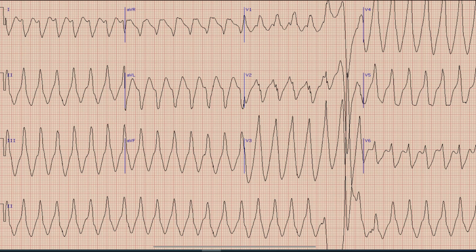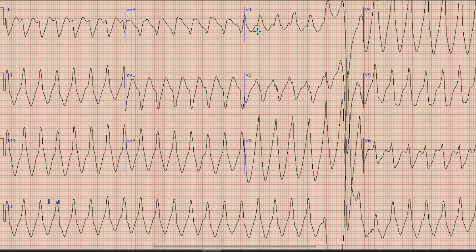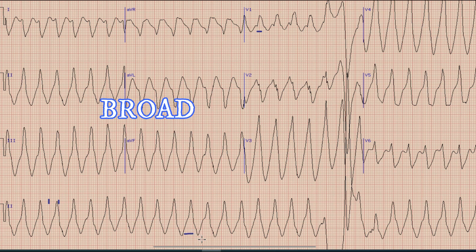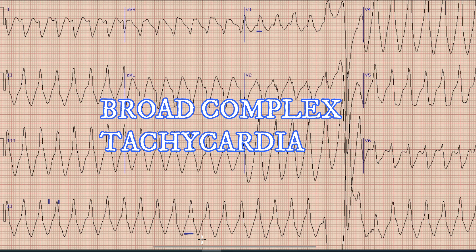Let's begin the discussion. The most prominent thing you can note on this ECG is that there is a tachycardia with a heart rate around 140 to 150. Also, there is a broad QRS — the QRS complexes are broad, as you can see here. So this is a broad complex tachycardia.